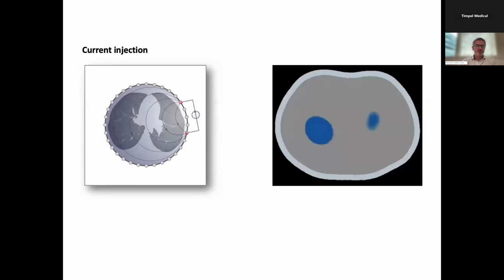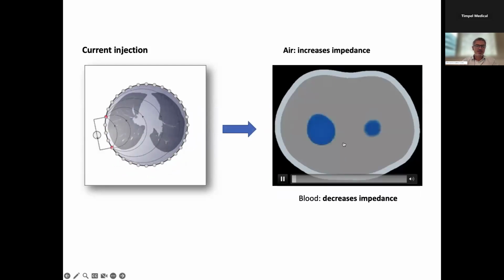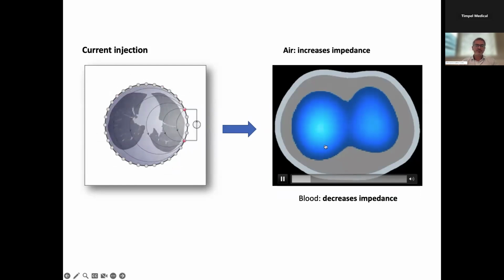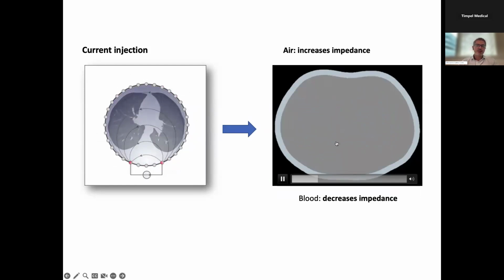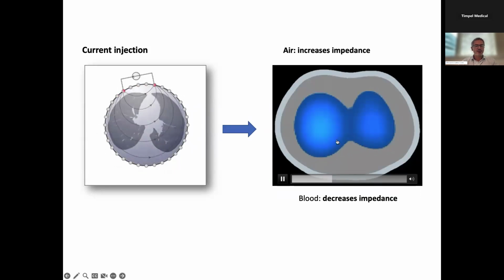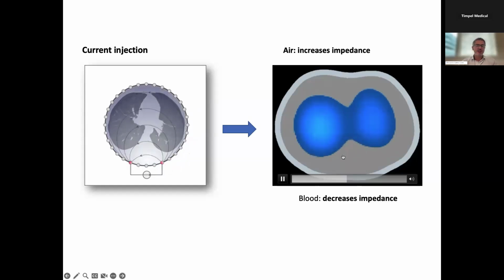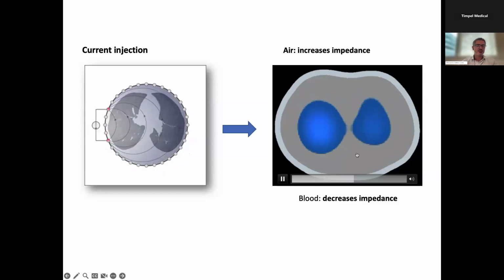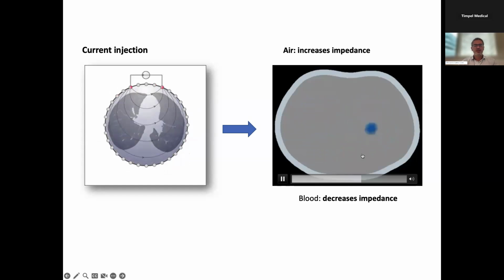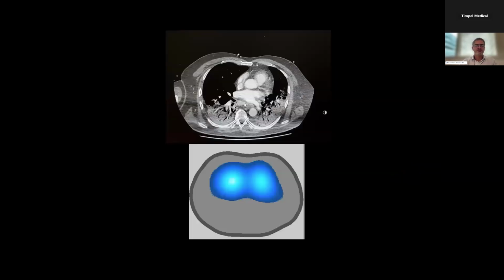So the image is something like this. You get different shades of blue. The lighter blue indicates more air coming in and out of the lung. The darker blue, less air. And when it's gray, it means it's a silent zone: no air coming in and out, no ventilation to a certain region of the lung.